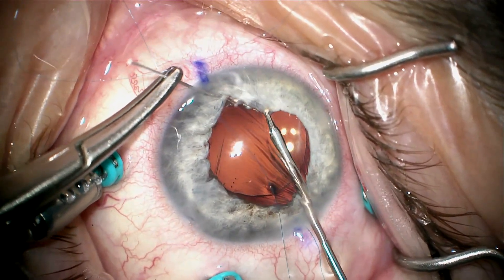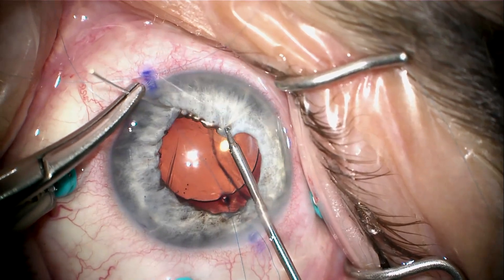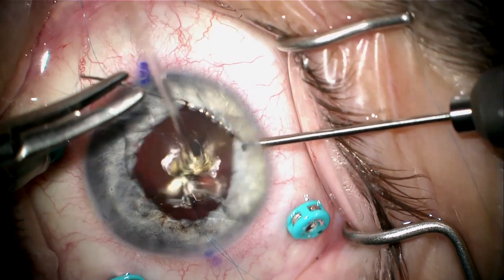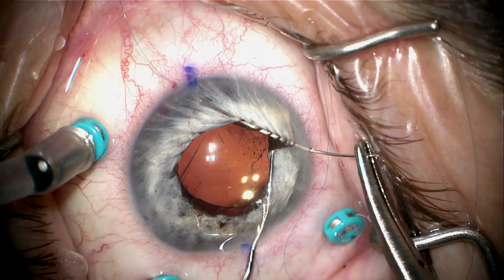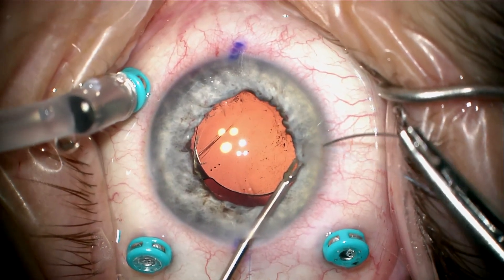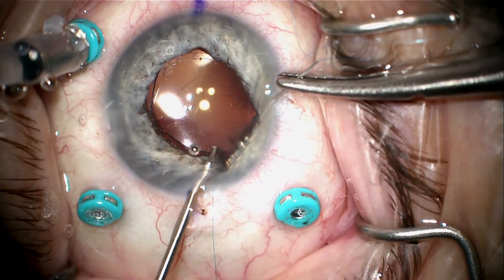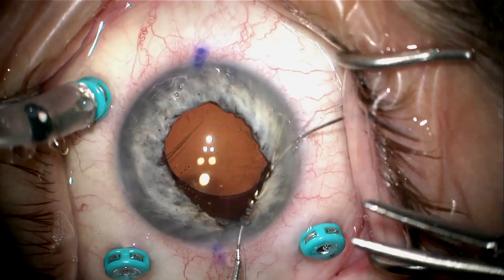Holding the needle with the left hand and doing the heavy lifting with the right, since I am right-hand dominant and want to take advantage of that. The angle is better when I hold the needle with my left hand, and I want a needle holder strong enough that the needle doesn't wobble. We pull this out while holding the iris back, maintaining enough viscoelastic so the eye isn't too soft. We're now going counterclockwise for this final 90-degree segment.